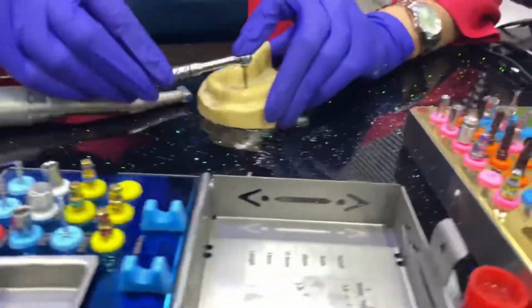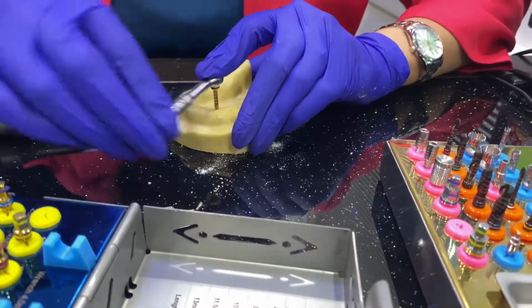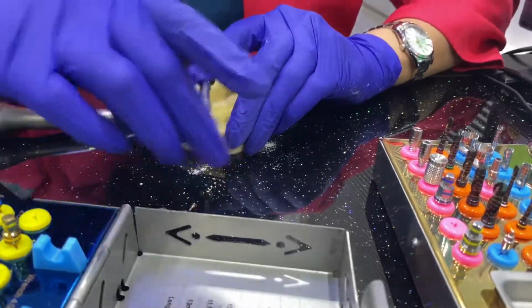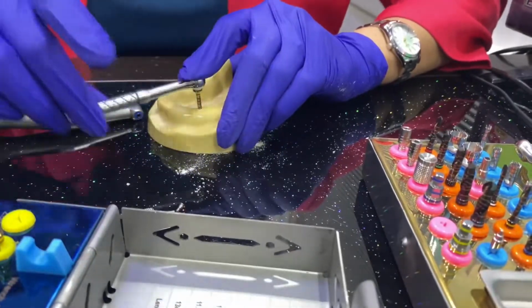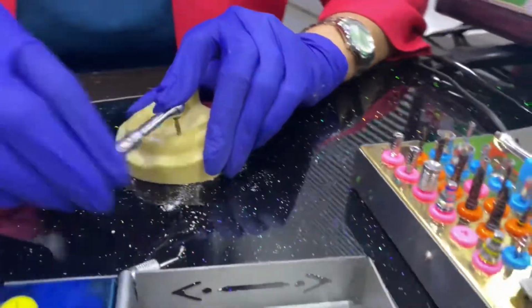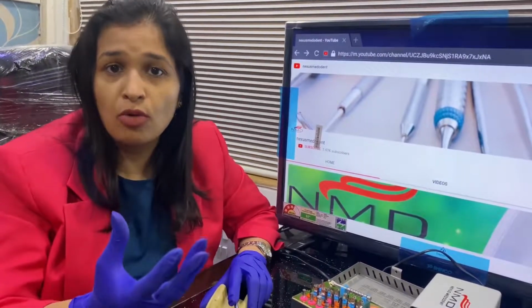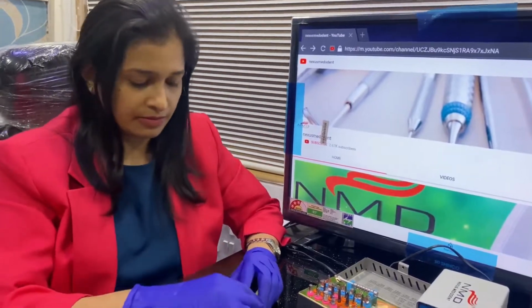So you will slowly keep torquing this inside. Depending on the quality of bone, D2, D3, the expansion will happen. Also, very important is when you see your CBCT scan, you will see how much amount of alveolar bone is there. If a good amount of alveolar bone is there, expansion will be easier.